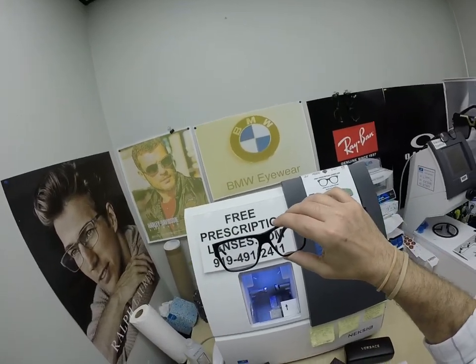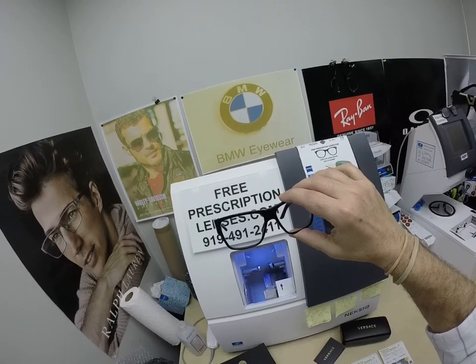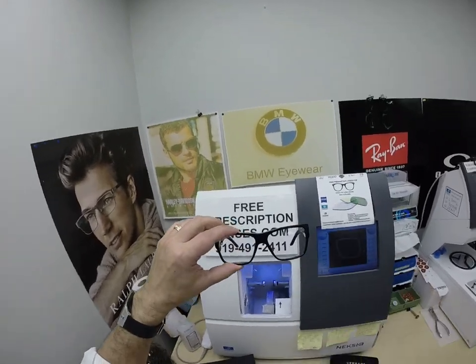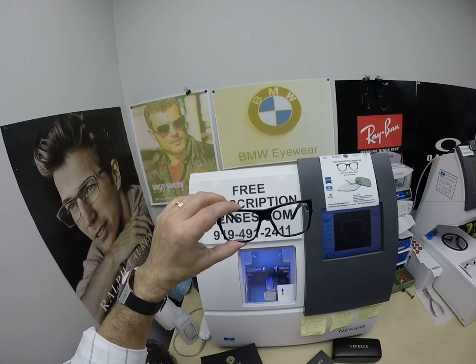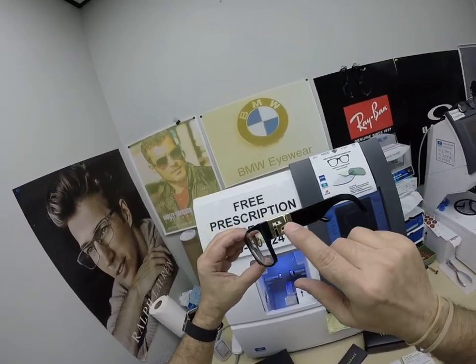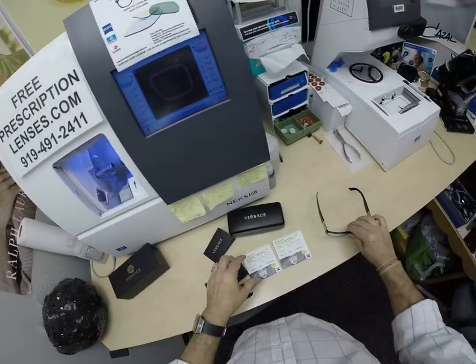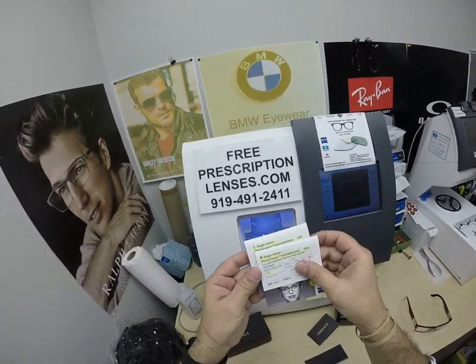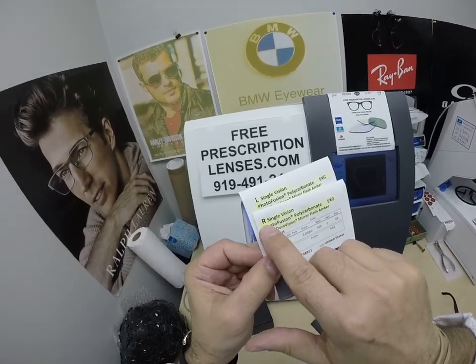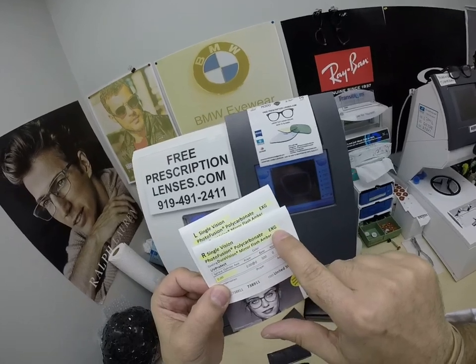Will got the non-prescription Zeiss Photofusion Extra Gray with the gold flash lenses. If there was ever a frame that takes gold flash lenses, it is a Versace, to complement the gold on the side. This is going to look really good. You're getting all the packaging from Zeiss. The R stands for right, single vision, Photofusion, polycarbonate, extra gray.